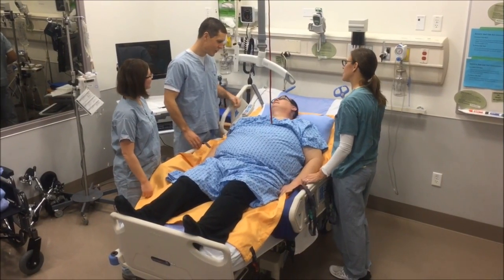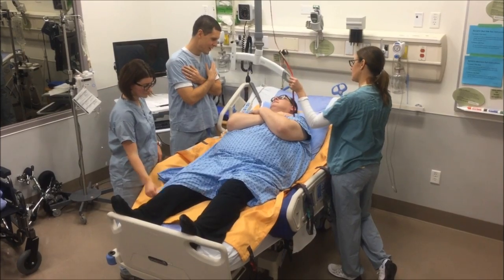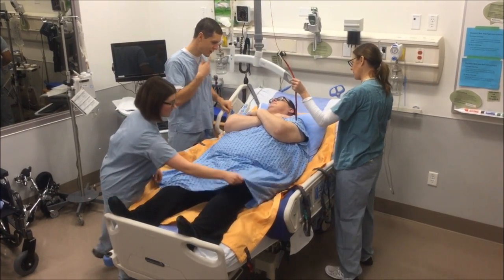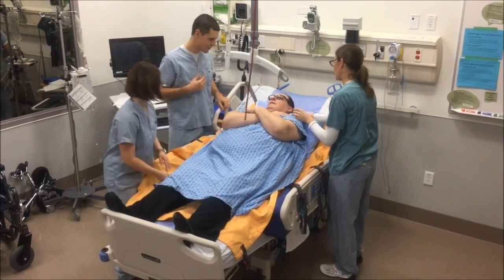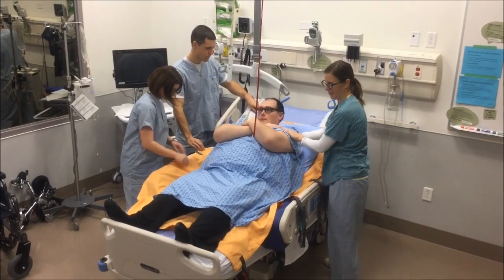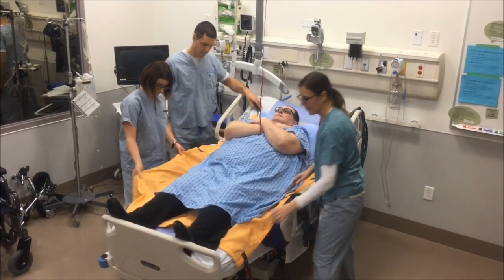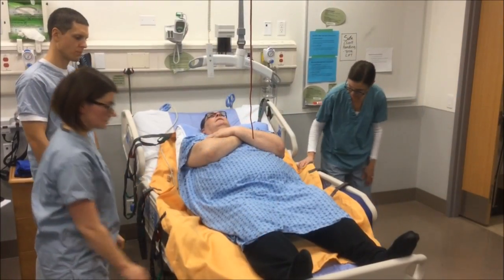To begin, explain the procedure to the client and how they can assist if possible. Protect the client's dignity by using sensitive language that avoids discrimination from weight bias and respects client privacy preferences. For example, you may say to the client, "Let's make sure we have the right equipment to ensure safety and make this process go smoothly," and "In order to make this process safer and more comfortable for you, we will be using a lift today."